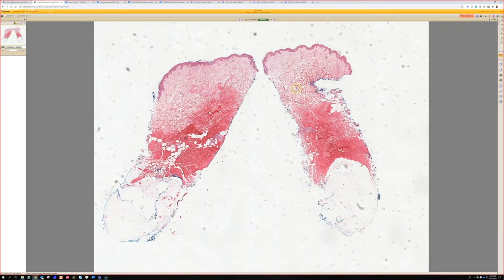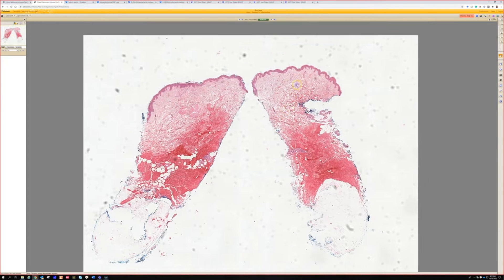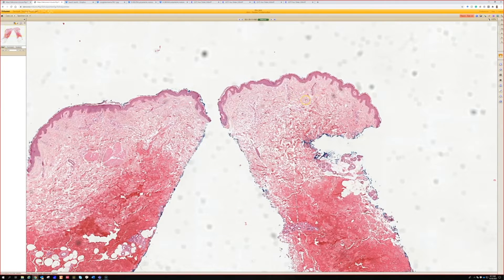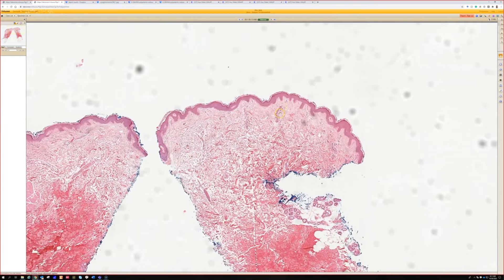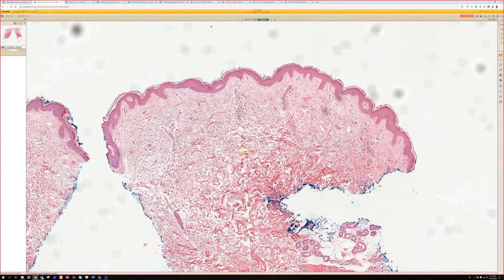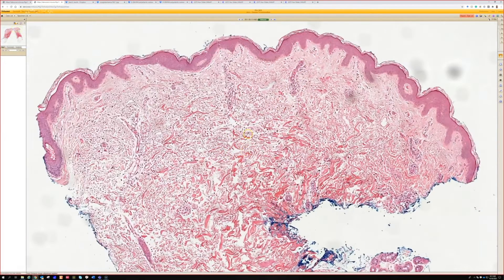Looking at this one from the interview, it looked pretty normal. One thing that caught my eye is there's some separation of the collagen fibers. The collagen has got a lot of white space between it — could be artifact, but this seems pretty prominent. So there's probably a lot of edema in here.